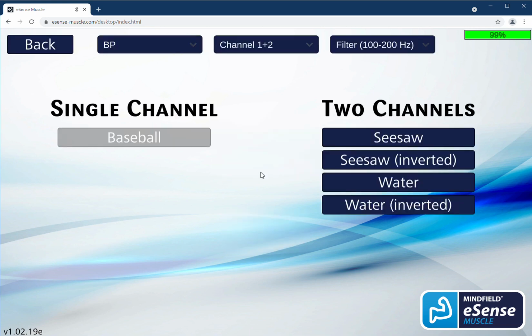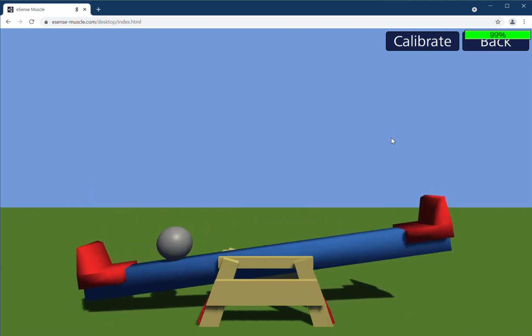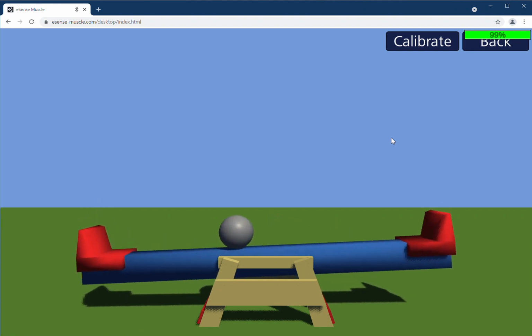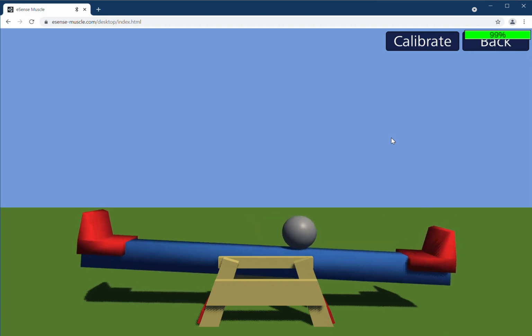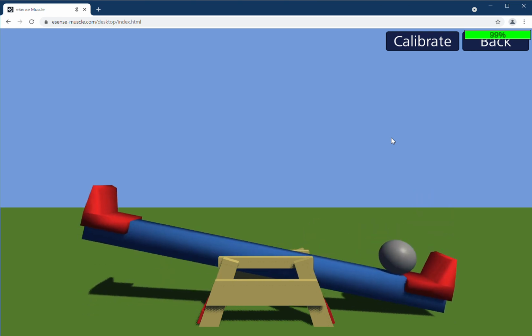The animations here are, in this case, single channel and two channel. And now I'm showing you two channel. And here we have the seesaw and a water animation. The seesaw is a simple balance animation. You see that this round ball is in the middle when both channels are contracted or loosened the same way. So if I now contract the left channel, it goes down on the left side and rolls to the left. And if I contract the right channel, my right arm, it goes down and rolls to the right, as you can see.